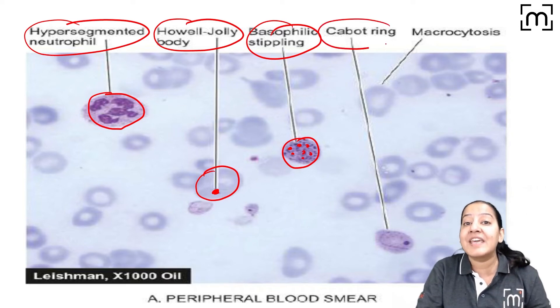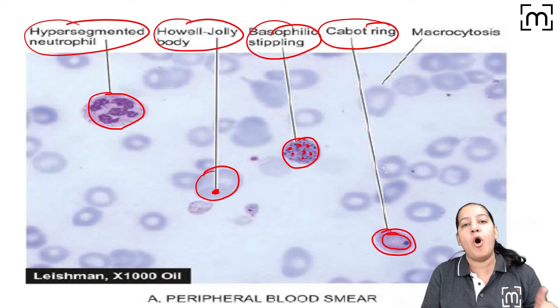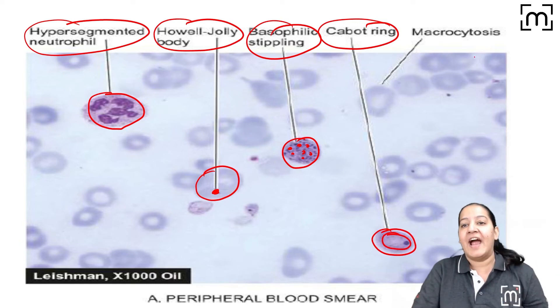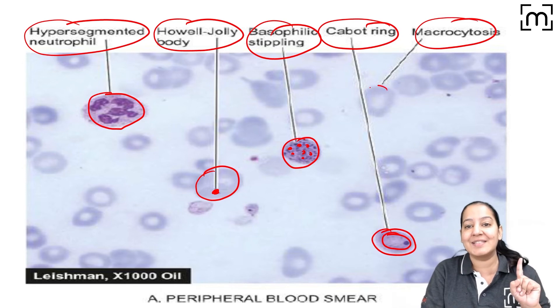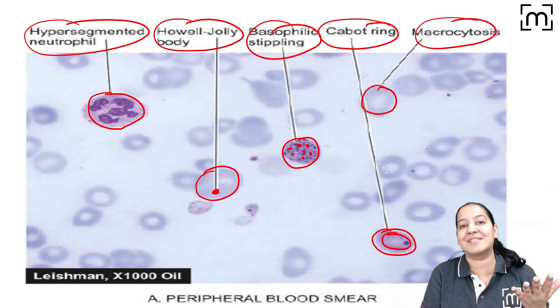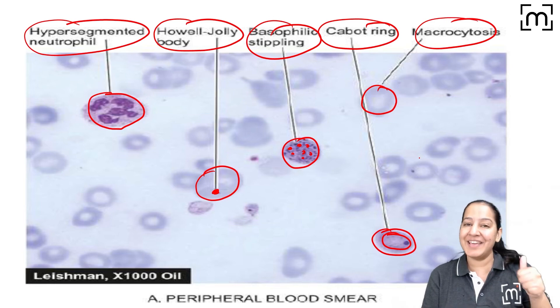The fourth is the Cabot ring. It is a strand either in the shape of a loop or in the shape of a figure of 8. And the last one is macrocytosis. You can see the size of the RBC is larger compared to normal and the MCV is increased.